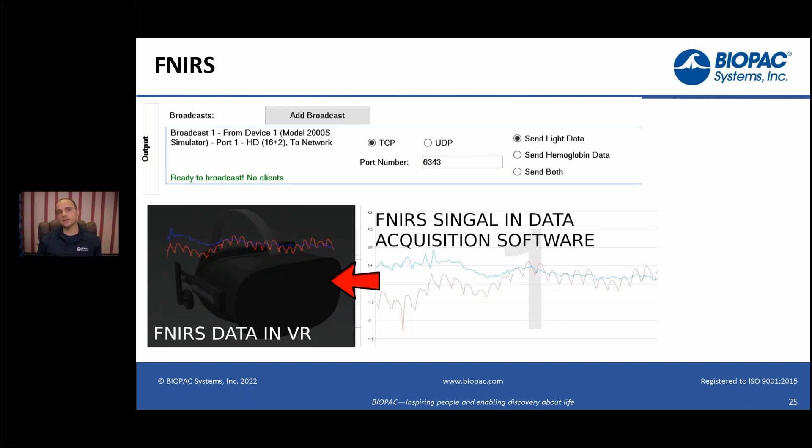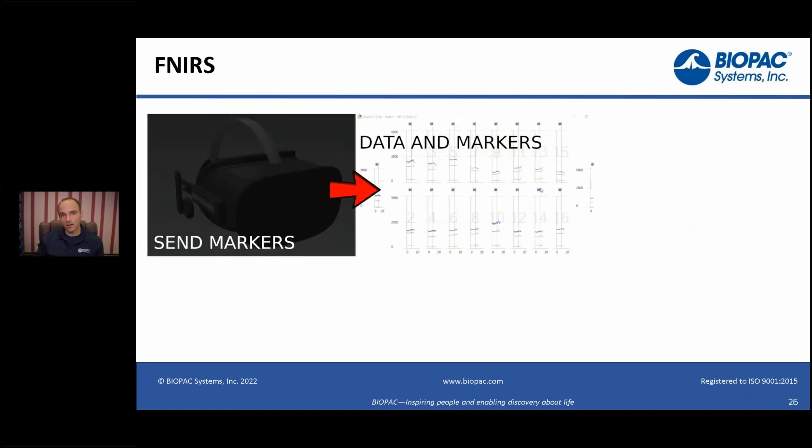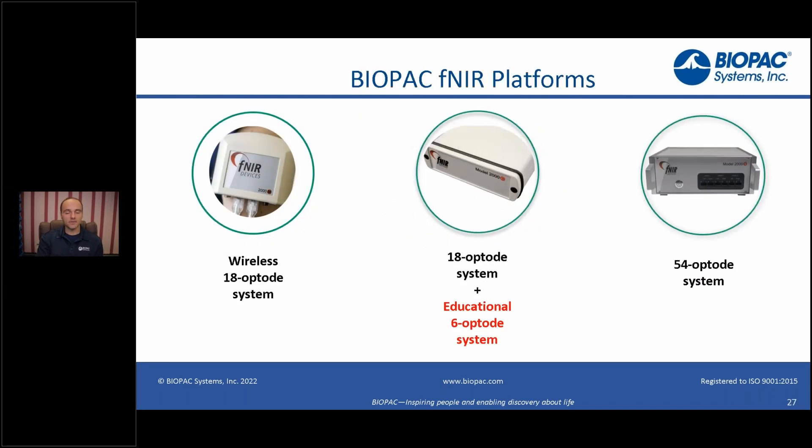Functional near-infrared is used for measuring cognitive workload, among other things. We have tight integration with the system, so we can stream in real time the oxygenation data into the virtual world — you can use that for biofeedback. You can see here how it's streaming the data back into the world. We can also send markers, just as we can to other systems, so the functional near-infrared system knows when I looked at the chicken, the creature at the soccer bowl, etc. — all these things can happen automatically.